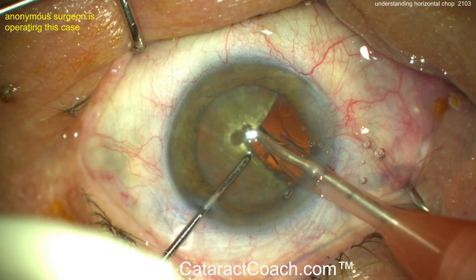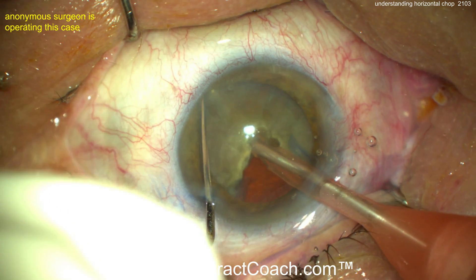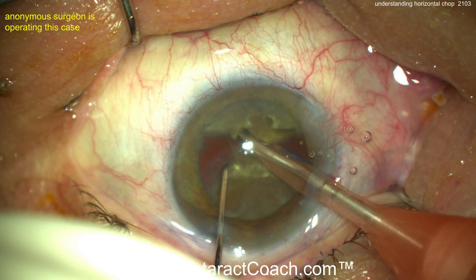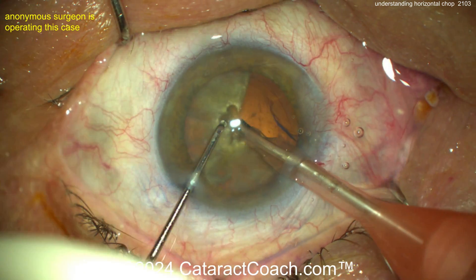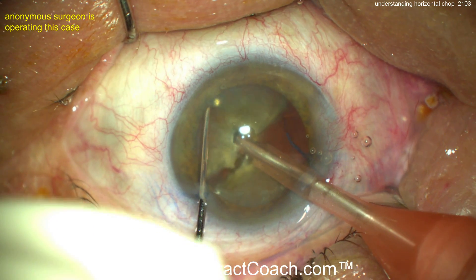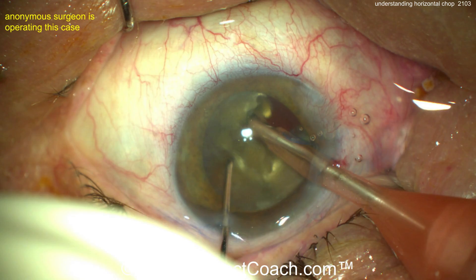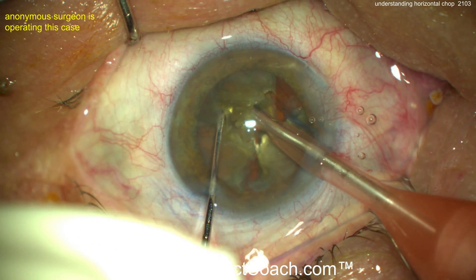Rotate the nucleus again. Watch carefully: buzz in with the phaco probe, get occlusion, chopper around the equator, bring the instrument towards the phaco tip, then apart to propagate the chop — and there you've got a nice split. You can do the same thing again with this heminucleus, holding it with vacuum power and then performing the chop.